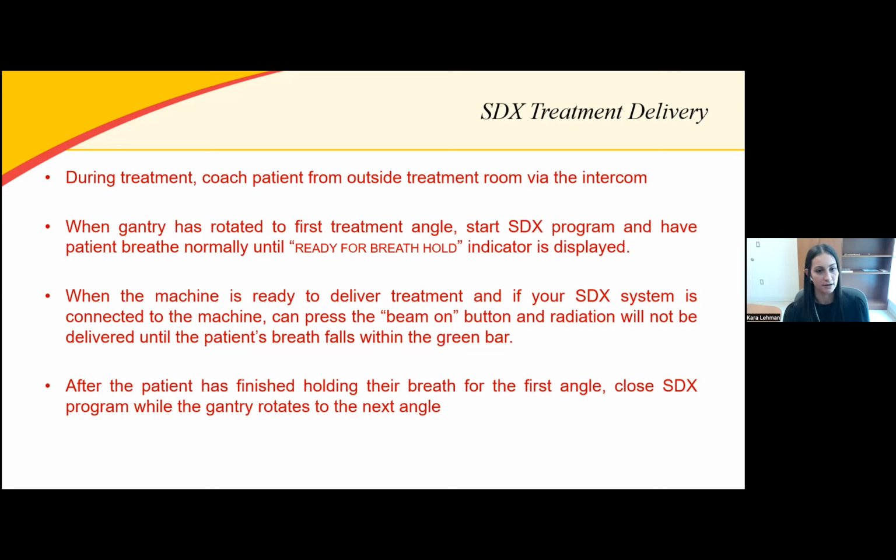If your system's not automatic or linked to your treatment system, that's okay. It'll just be exactly like you do during the CT simulation, where you'll just manually have to start and stop the radiation beam according to when the patient's in breath hold.